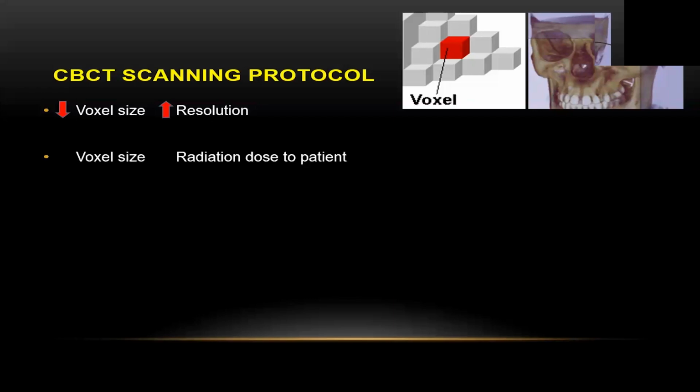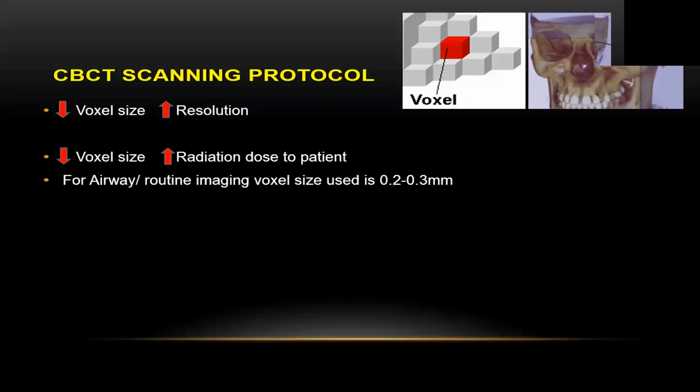Why do we not always stack the most amount of cubes, get the shortest dimension or setting on your machine, and get the highest resolution image? Because it also increases the radiation dose to the patient. Again, briefly talking about it.